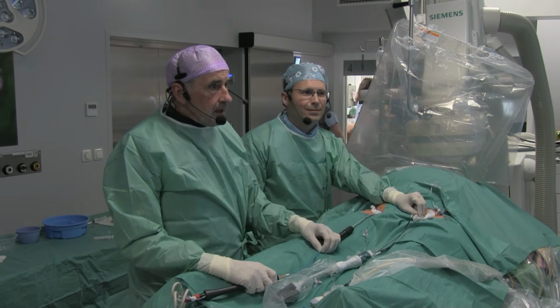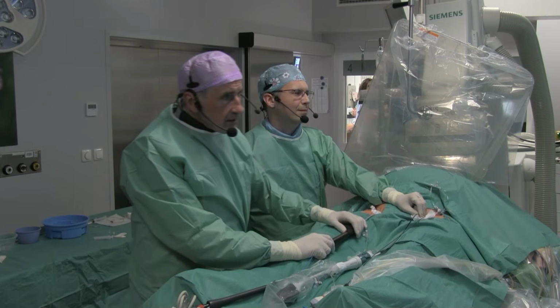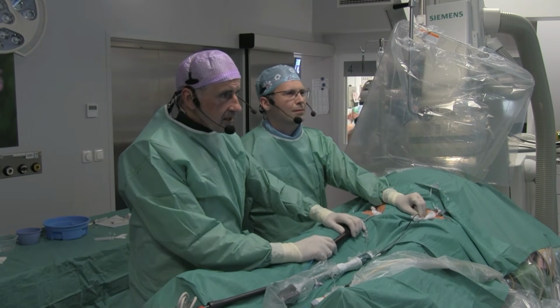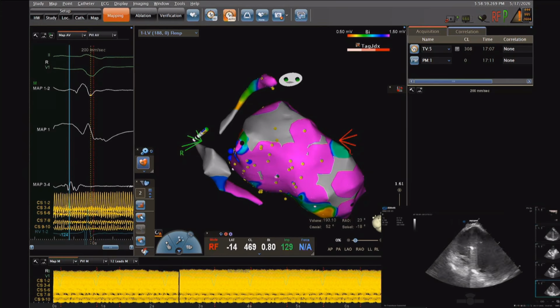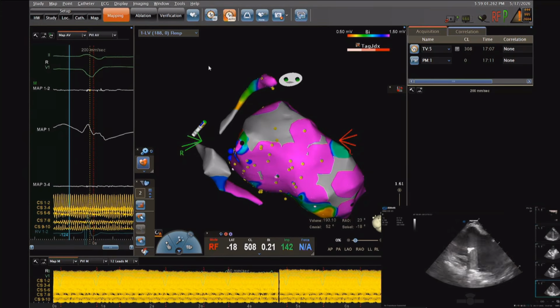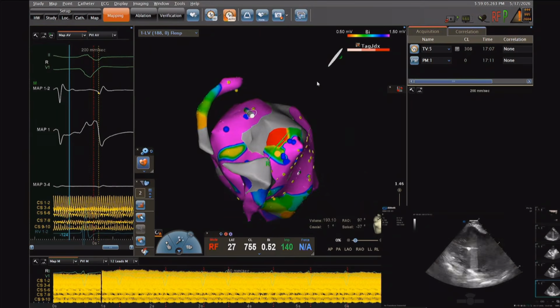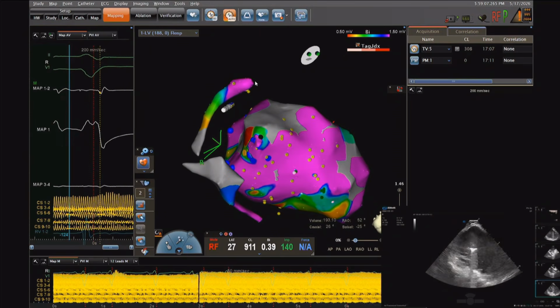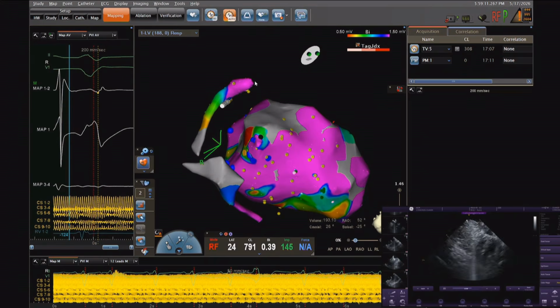Hello, EChem. Hi. We have a problem that we could not induce tachycardia for a long time. Then we induced tachycardia, which I don't know if it's the one which comes from the real aneurysm, but maybe we will introduce the patient. All right, can we get the slides, please?